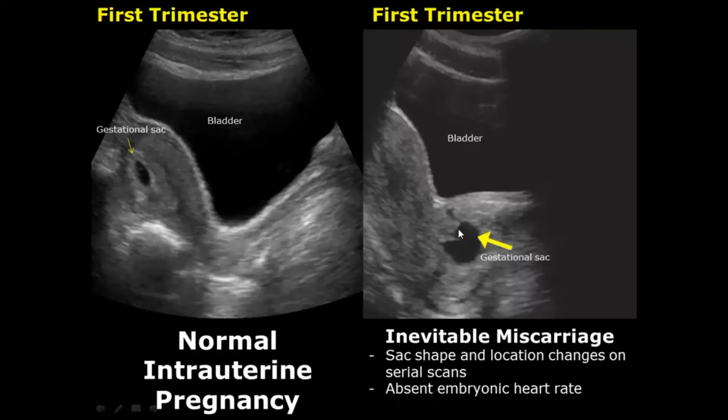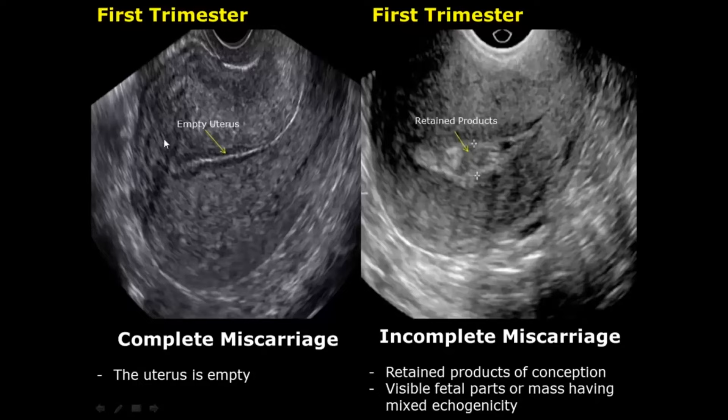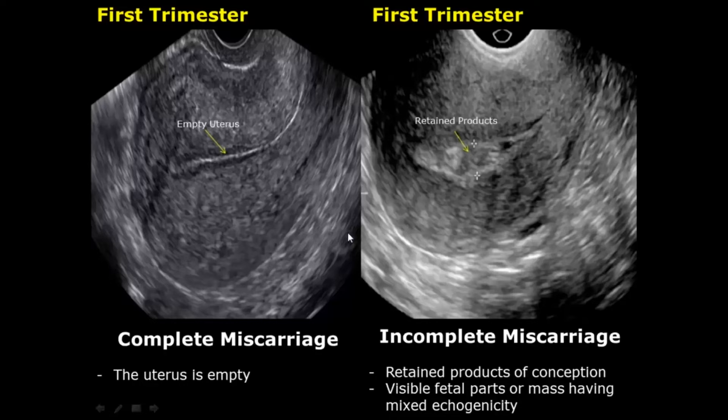The embryonic heart rate may also be absent in an inevitable miscarriage. A complete miscarriage occurs when all fetal parts and pregnancy tissue have been expelled completely from the uterus and the uterus is empty. In an incomplete miscarriage, there will be retained products of conception left behind in the uterus — fetal parts or some remaining placental tissue of mixed echogenicity.